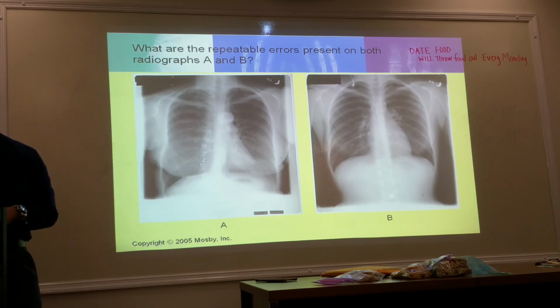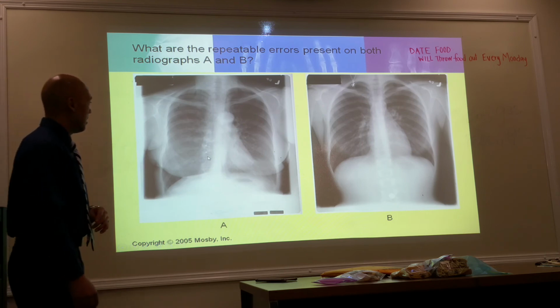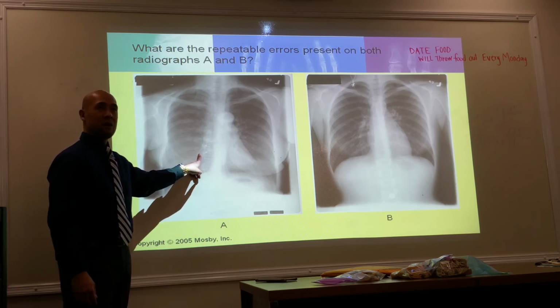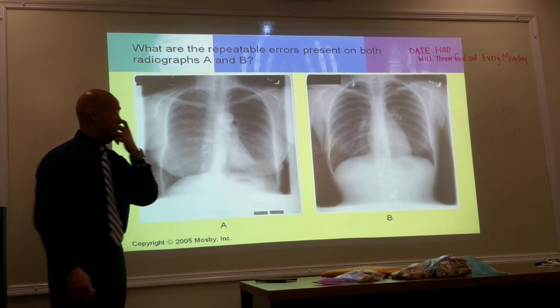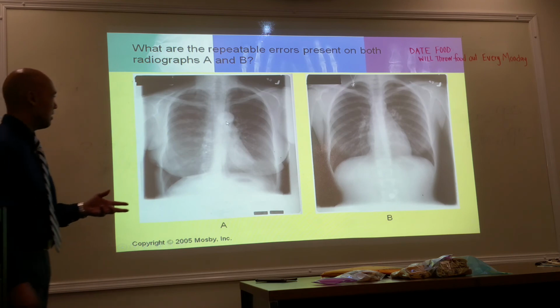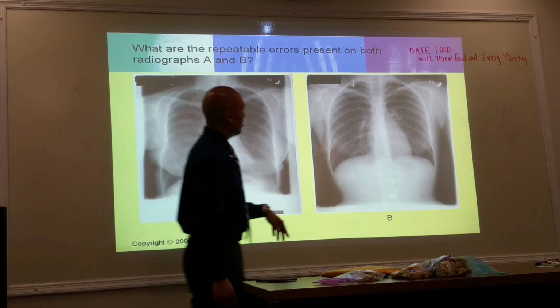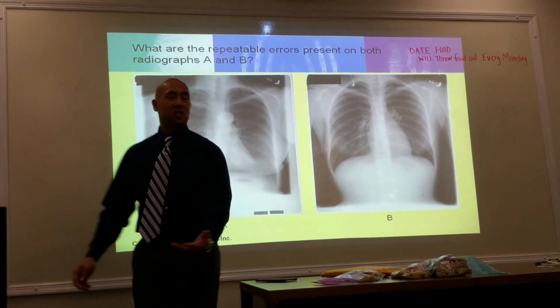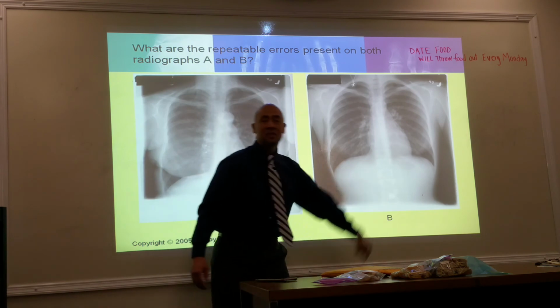Okay, so there's a question right here. Did you guys see that? It's the snaps on the bra. Position's good, contrast is good. Maybe a little bit too high, I can bring it down a little bit, but this is an artifact repeat. Okay, this is also an artifact repeat. Look at that. What is that? Is that a button? That's the button from the jeans. That's how low they are. As you can see, the buttons on the jeans.